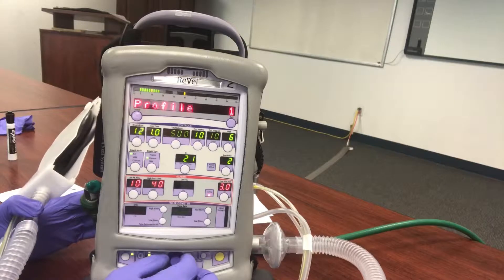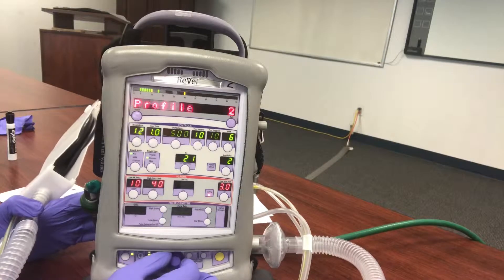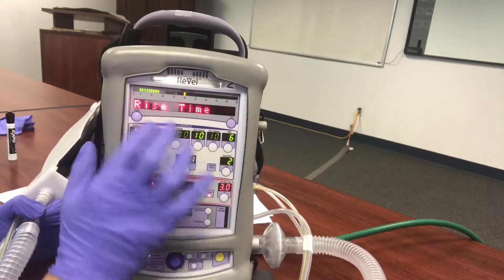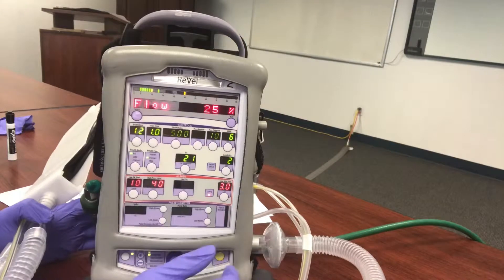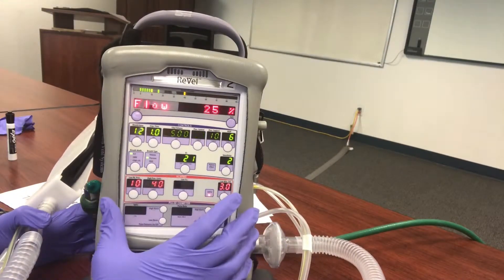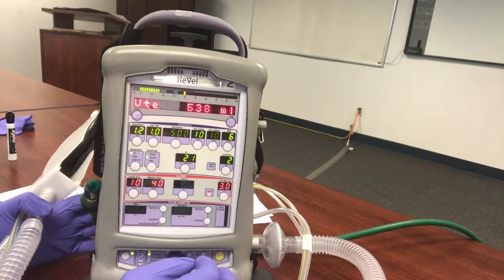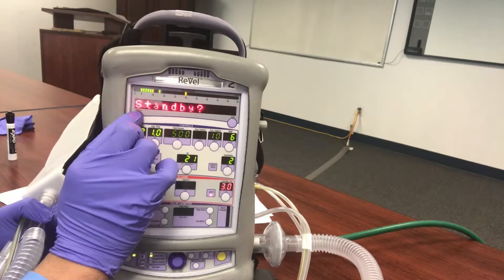These profiles are presets that your biomed department has configured. Just to play it safe, I'm going to go to Profile 1 and select that. Then we'll scroll to Flow Termination — this is set at 25% by default, which is set for a ventilator. If you put this on your BiPAP patient the breath would be too big, too strong, and terminate too fast. 25% is perfect for a ventilator setup but not for NPPV.